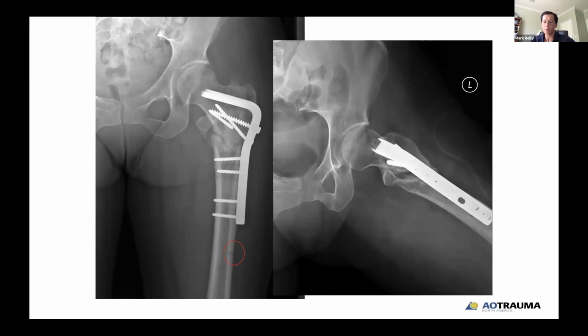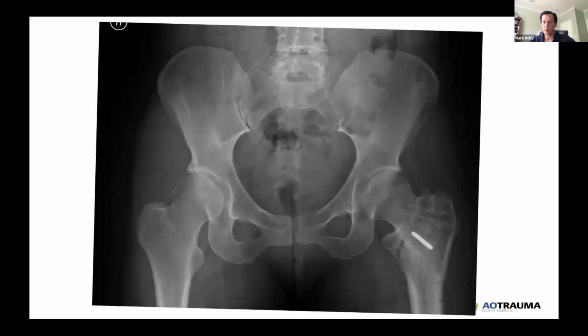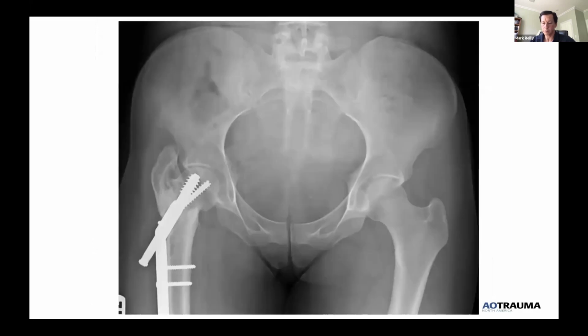And now the compression would hold. There was no bone graft added. I didn't do anything except compress. And about 3 months later, you can see she's completely filled that in and healed her osteotomy, and then had her hardware taken out a while later.